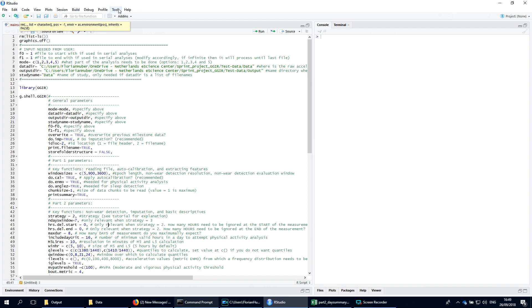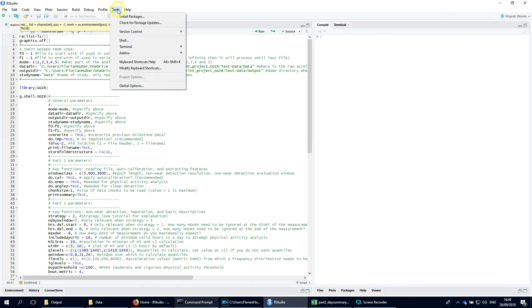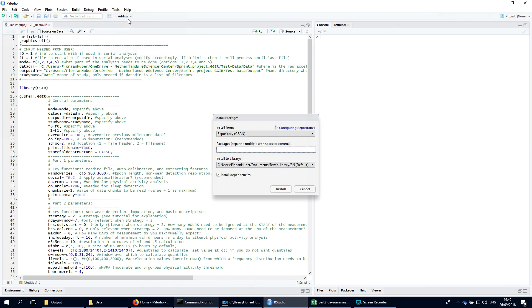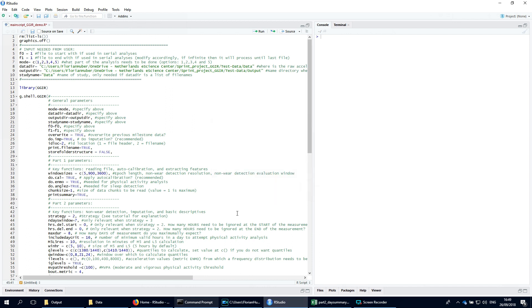Once R has been installed, the GGIR package can simply be installed from the toolbar. But we have already installed it, so we do not have to do that now.